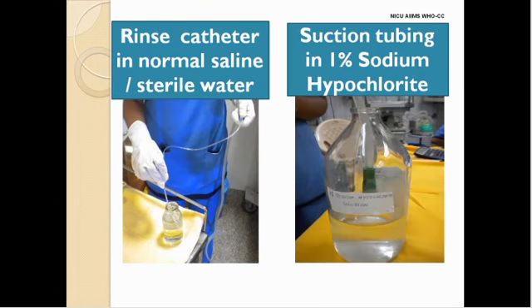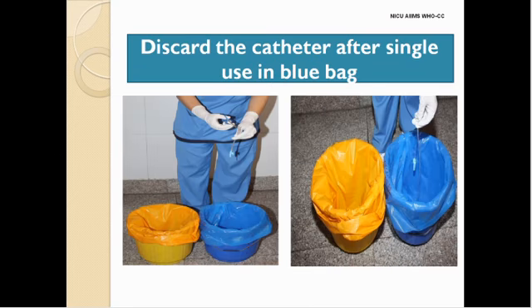You have now done the suction, and what to do now? The suction catheter should be cut and disposed of in the blue bag or as per the hospital recommendations. It should never be reused.